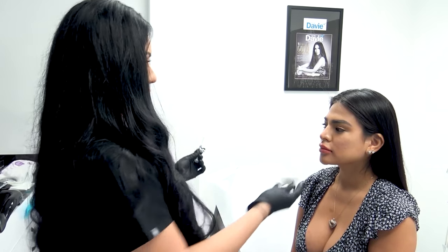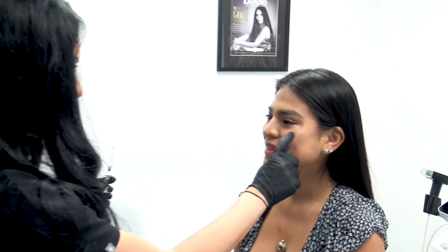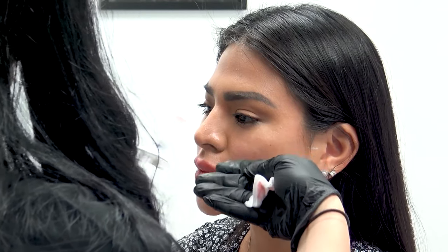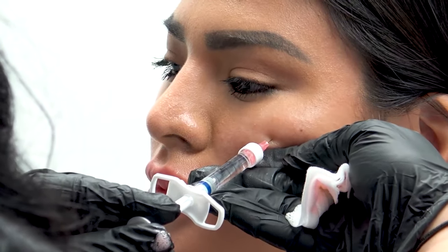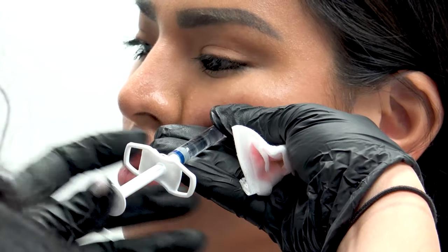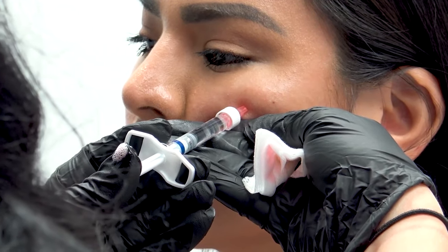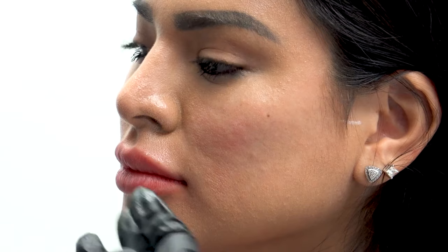I can really customize exactly where I would like the filler to be. I'm going to ask her to smile — she tells me she doesn't like that little depression in that area. I always like to see where the bone is and put my finger right underneath it without distorting the anatomy. I'm always pushing up in the direction I'm trying to achieve. I'm at the bone, I stabilize my needle, I aspirate, and then I slowly put a small aliquot — I usually start with about 0.1ml. I come out and reevaluate.